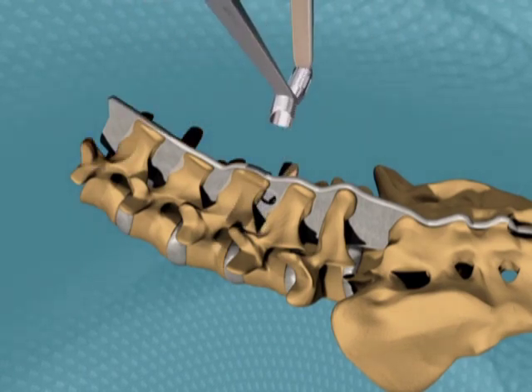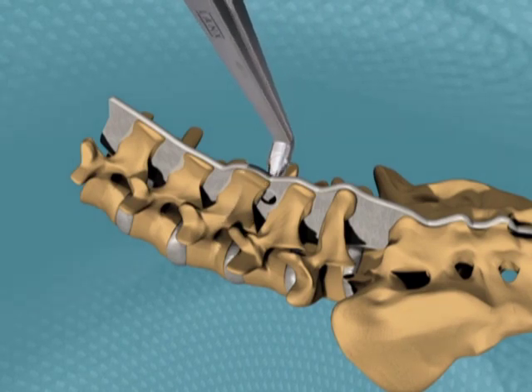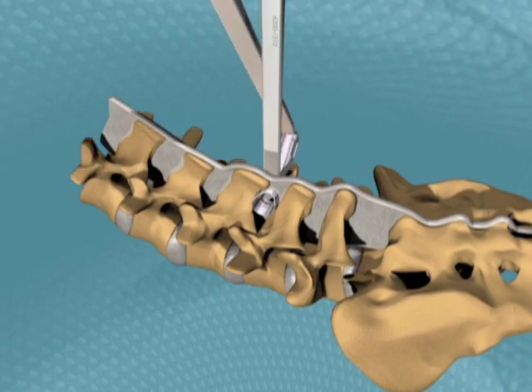Remove the rasp and slide the corresponding sleeve. Reinsert the rasp and sleeve together into the interspinous space. Keeping the sleeve in place, remove the rasp. You have now created a cannula for the post-plate side of the implant.